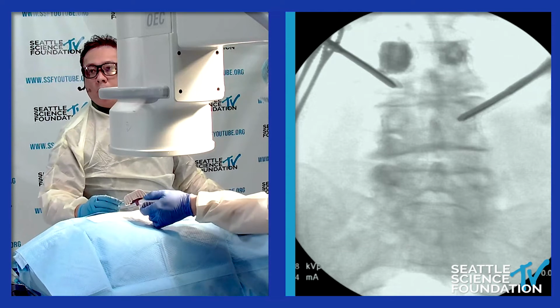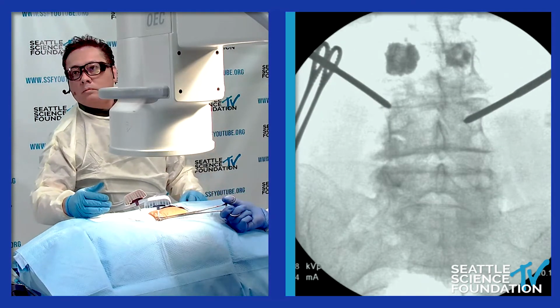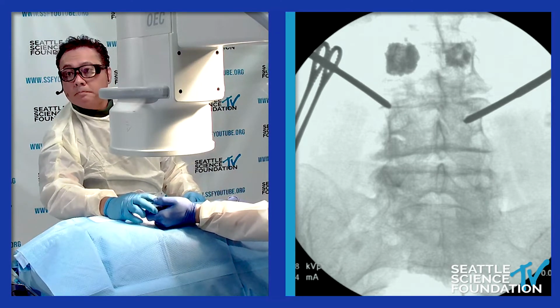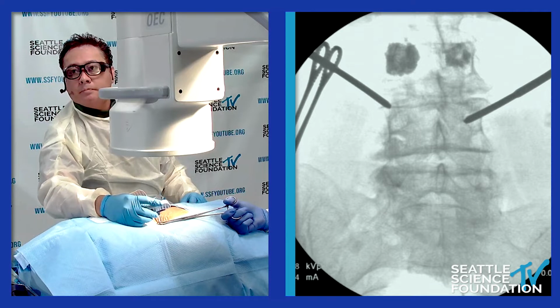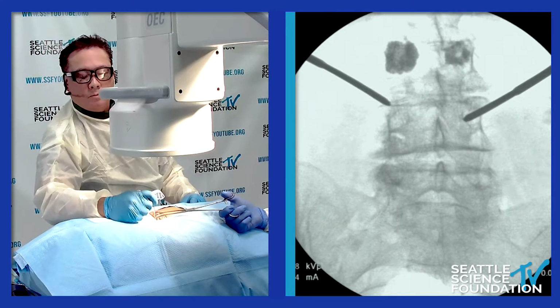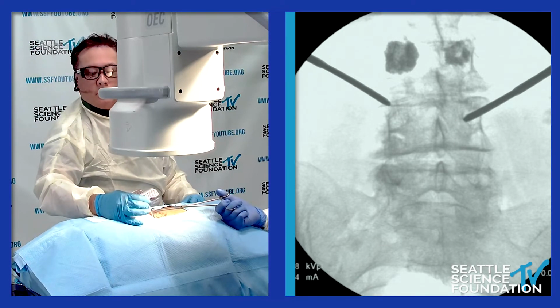I typically would use a unilateral needle, and I cross the midline on the AP, and then inject the contralateral side. Then pull the needle back up a little bit, and then inject the ipsilateral side. To access the area, we want to provide less medial orientation to it.